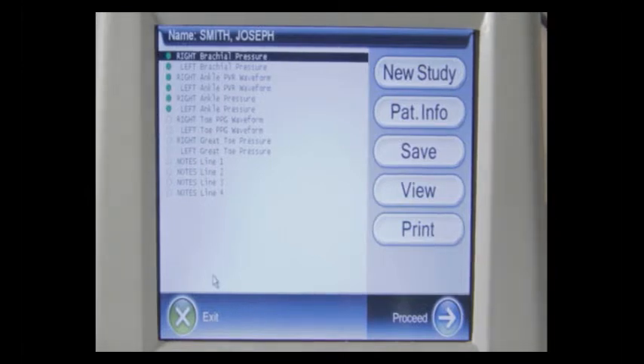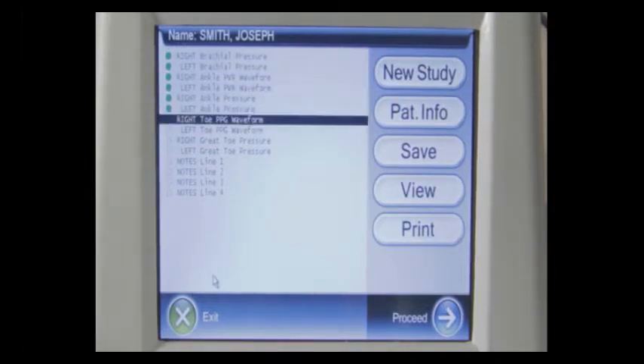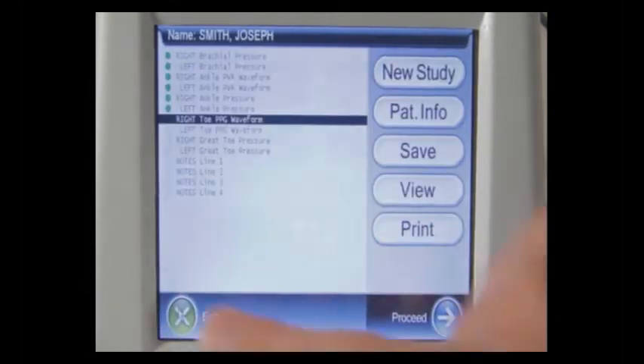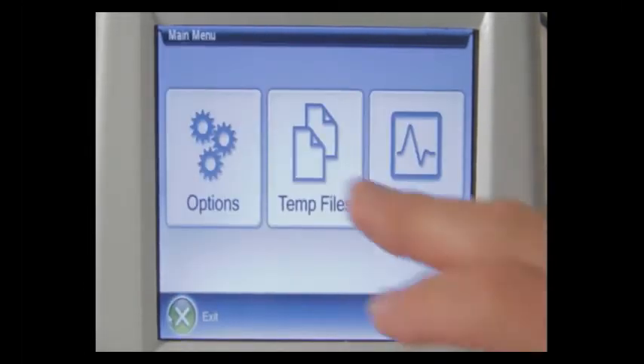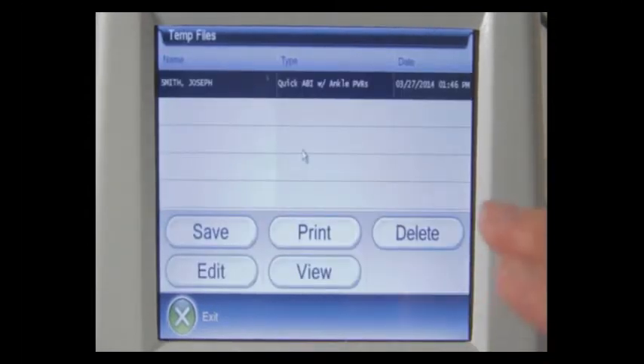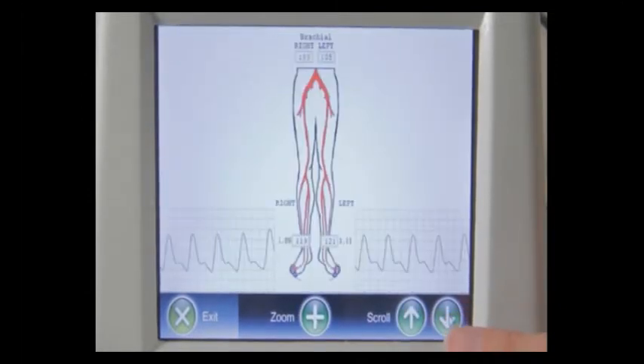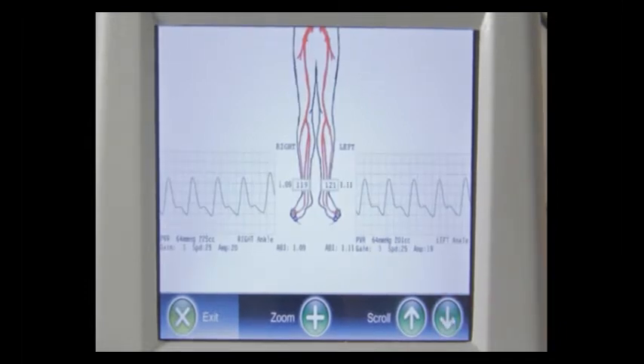If you wanted to proceed a little further, you could highlight, for example, the right toe PPG waveform and then press proceed to obtain that waveform. To view the page, simply use the view button and it will display the patient report in small size. If you want to zoom in on a detail, press the zoom button and then use your up or down buttons to scroll down the page as desired.